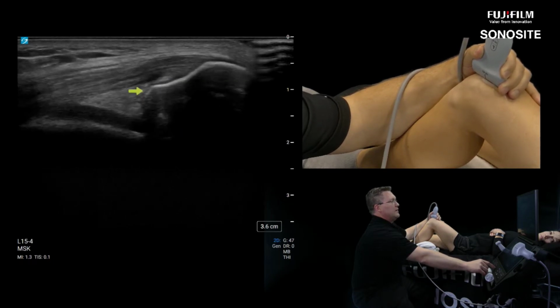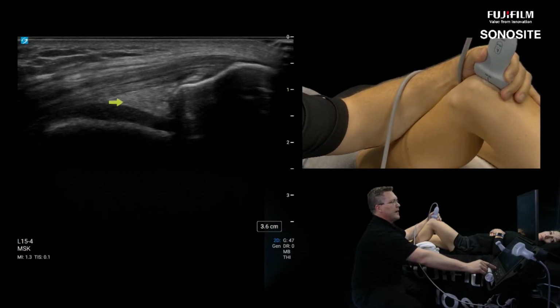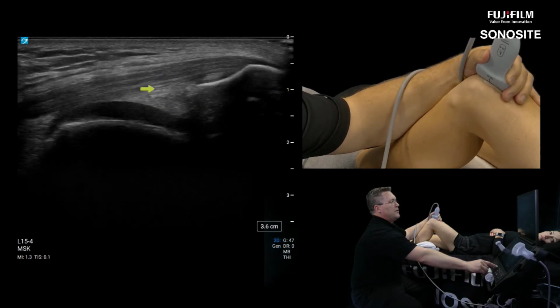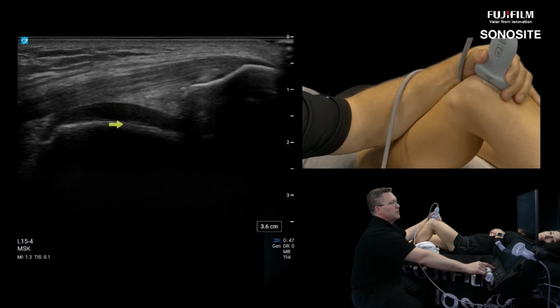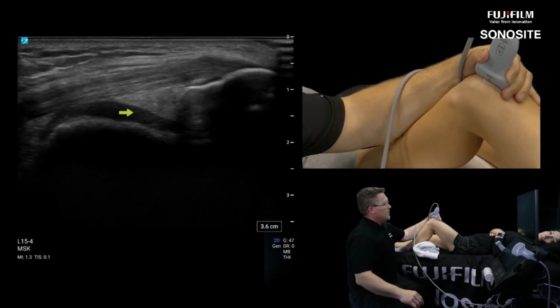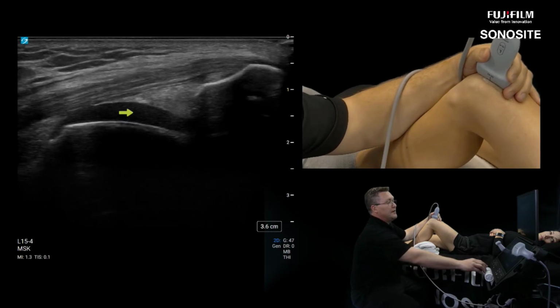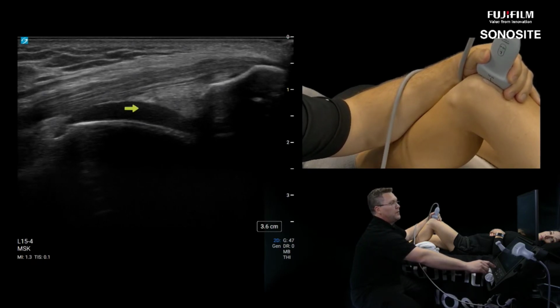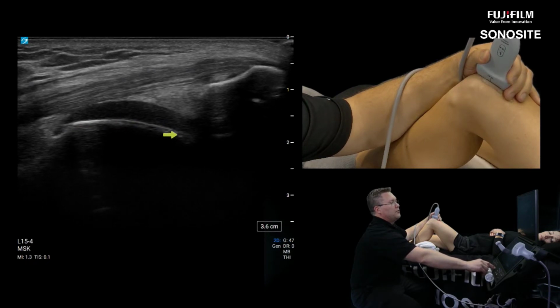And then when the knee is in this maximum flexion, we can really see that hyperechoic quadriceps fat pad. Very important underneath that, especially in this position, not to call this a joint effusion. This is just cartilage. This is anechoic. It's not compressible if I give it transducer pressure, okay? That is not compressing that. It is what fluid would look like, but fluid would be compressible. And then this is the chondral or the cortex of the distal femur trochlea, okay?